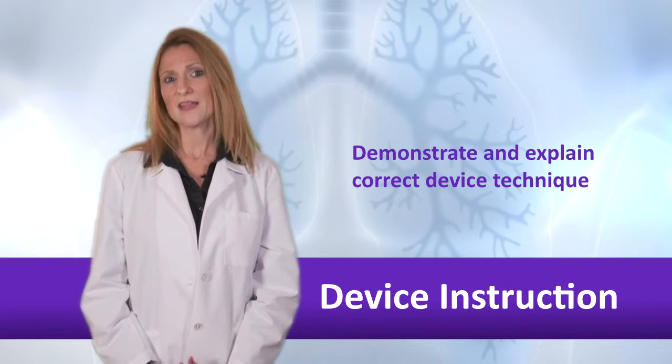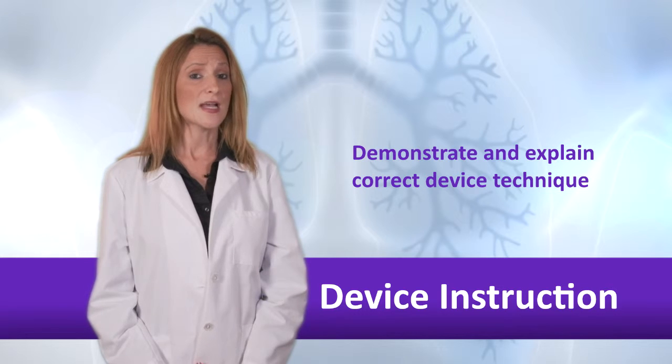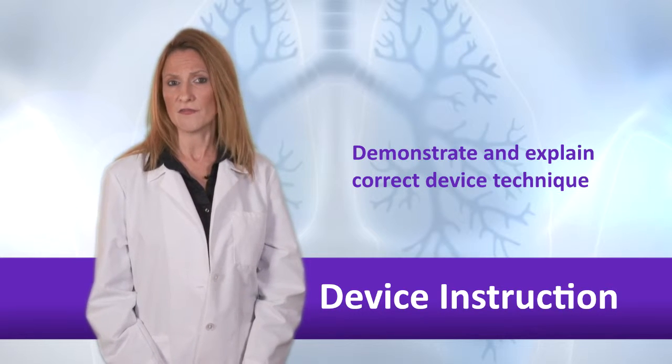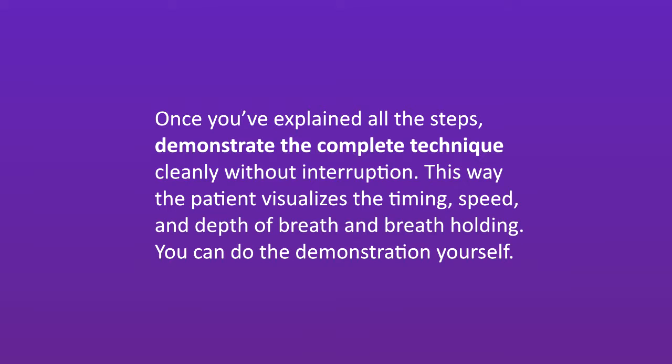Explain each step and its rationale in terms appropriate for the patient's cognitive level and health literacy. The logic behind key steps is not obvious to the typical patient. Without this explanation and emphasis, a patient is likely to skip steps they think are unimportant. Once you've explained all the steps, demonstrate the complete technique cleanly without interruption. This way, the patient visualizes the timing, speed, and depth of breath and breath holding.